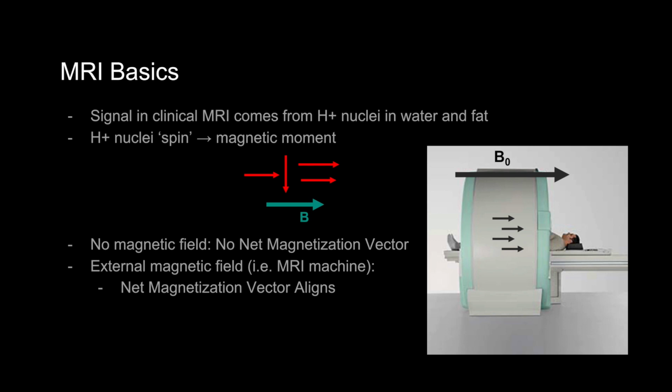When a magnetic moment is aligned in the field like we're showing here, this is considered a low energy state. Put more simply, the little bar magnets are naturally pulled in this direction along the Z-axis. It's easier for them to align with the field than to oppose it. The Z-axis, again, is the longitudinal direction down the bore of the magnet.